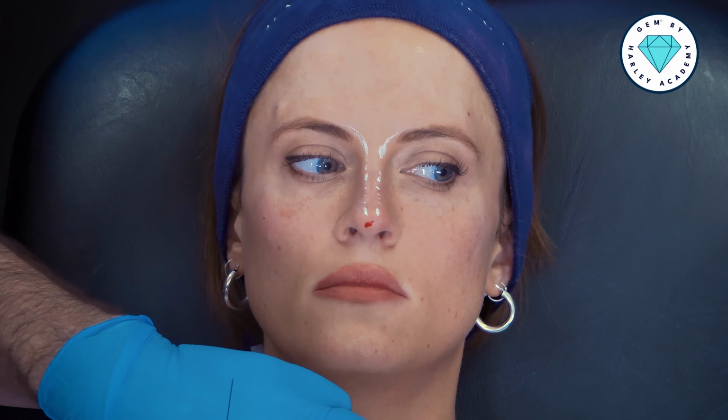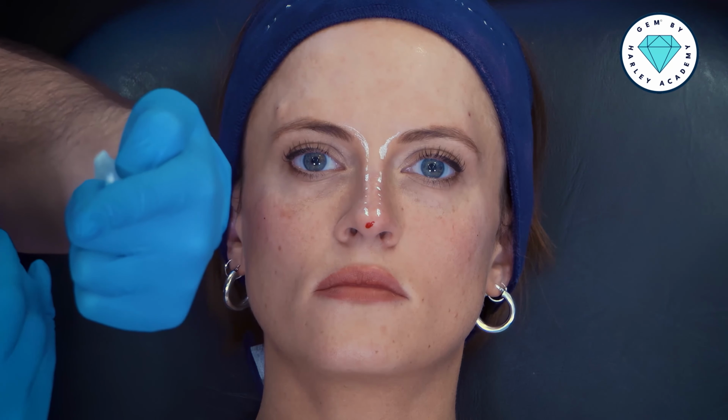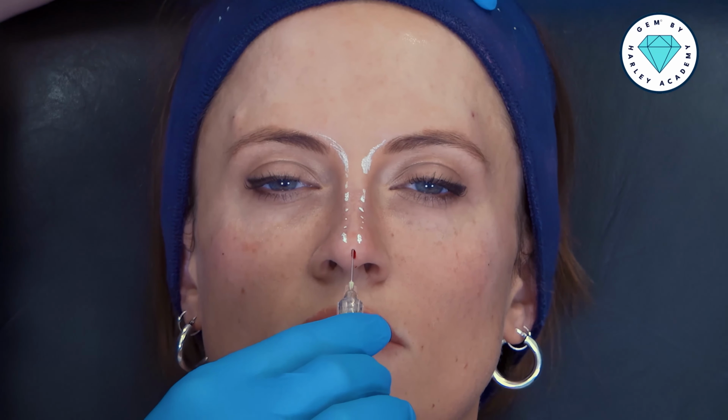With my cannula, I've got the exit port of the cannula facing forwards so that the projection of the filler is going in the right direction. And now we can start to treat. So as we move through the very, very thin subcutaneous plane, we have to push through the fibromuscular layer 3 until we're in the deep plane of the nose. And it will look a little bit like this.